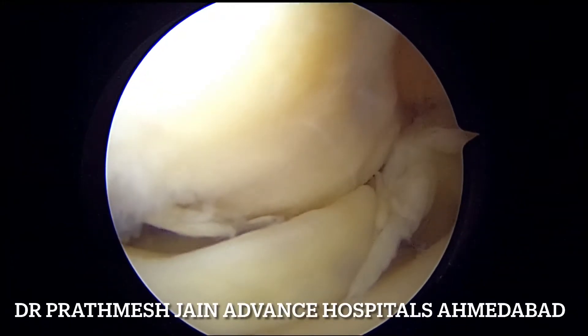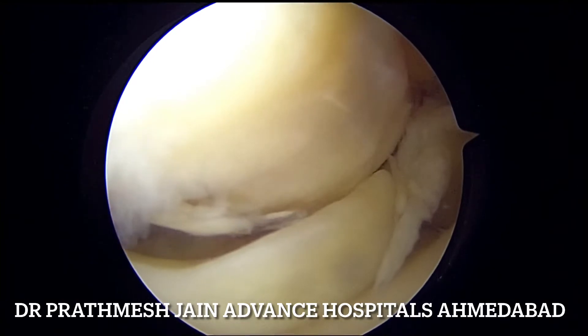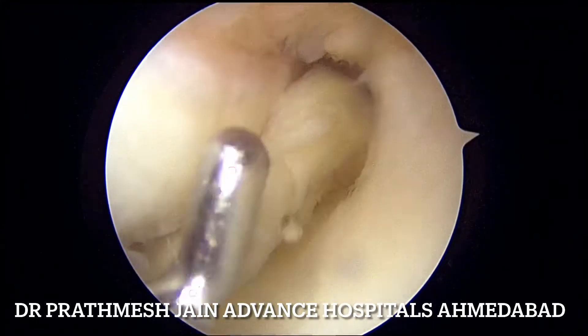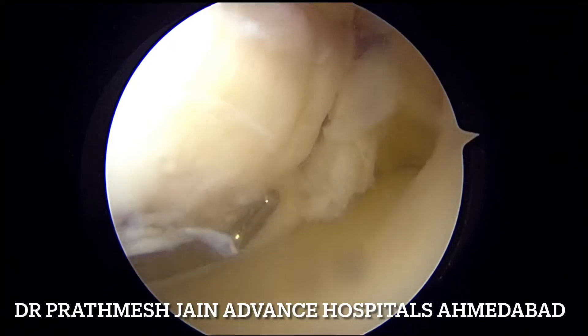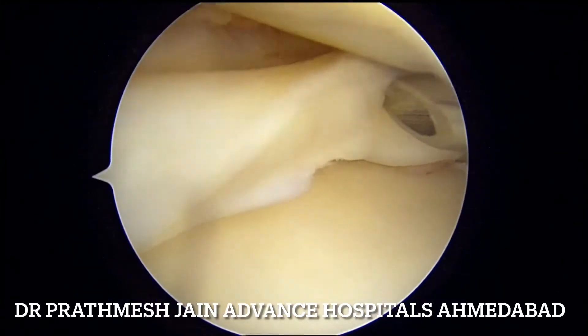We are demonstrating a very complex case of medial meniscus tear which has got a bucket handle component along with complex tear and radial component as well. This tear is a very bad tear — a bucket handle sort of tear which is locking into the joint and it has a posterior complex component as well.